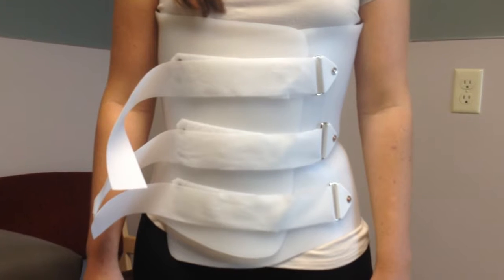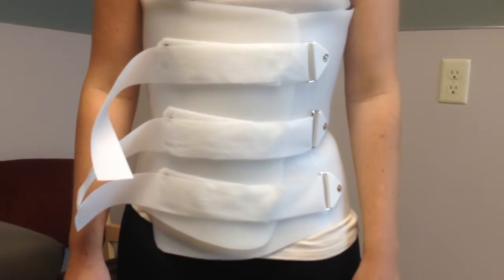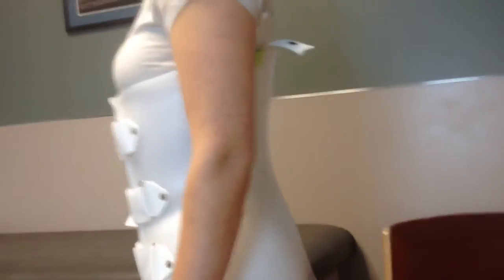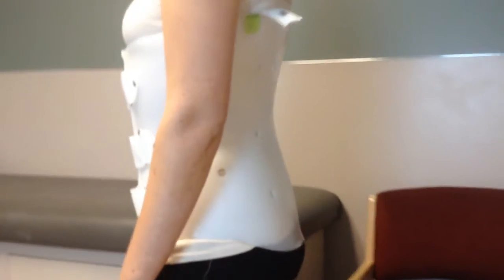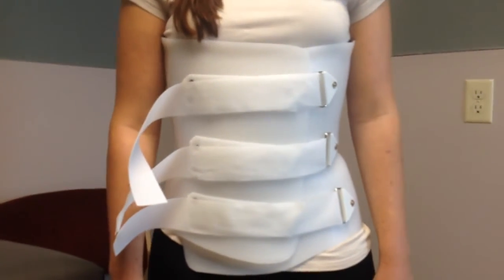There are three Velcro straps that you use to tighten it, loosen it, or take it on and off. It's supposed to go under the breast area and to the top of the thighs, and in the back it's a little bit longer — under the shoulder blades and above where the chair is. So that is a custom overlap LSO.